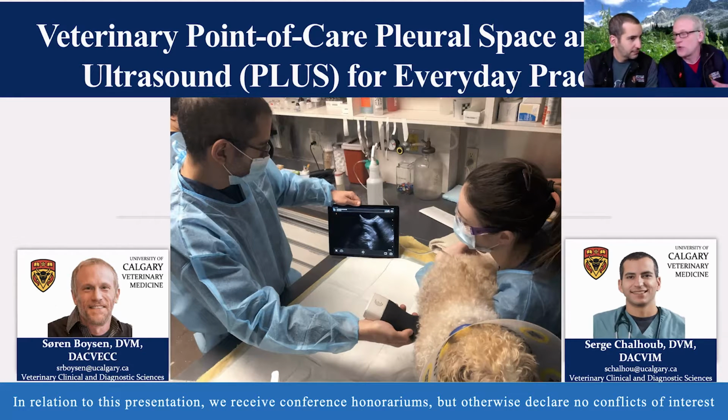But we are going to go through some of that. We're going to give you guys a good feel for why we're using point of care ultrasound. As you can see in this image here, this is you, Dr. Chalhoub, with your mask on. It's a current image. You can see how easy it is for us to gain information right there at the cage side, or even with an owner.